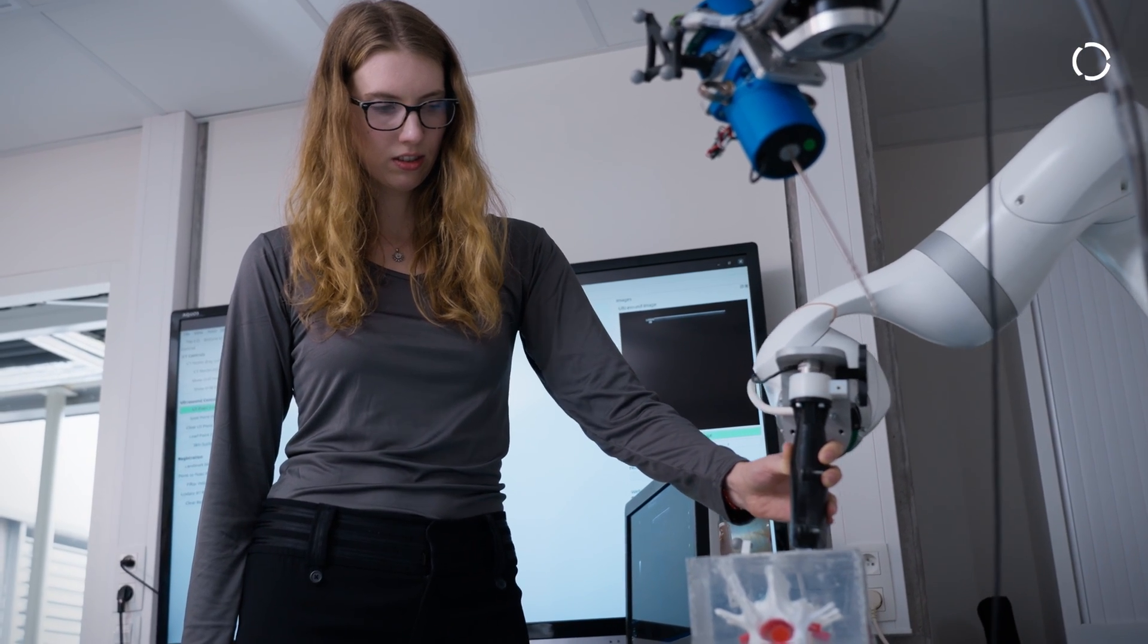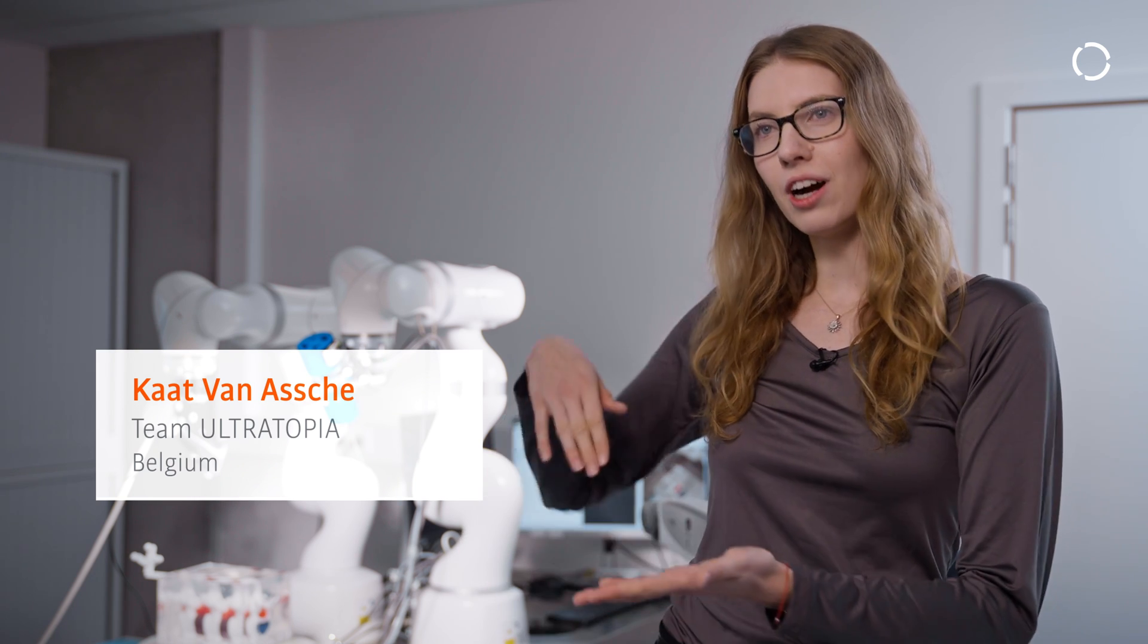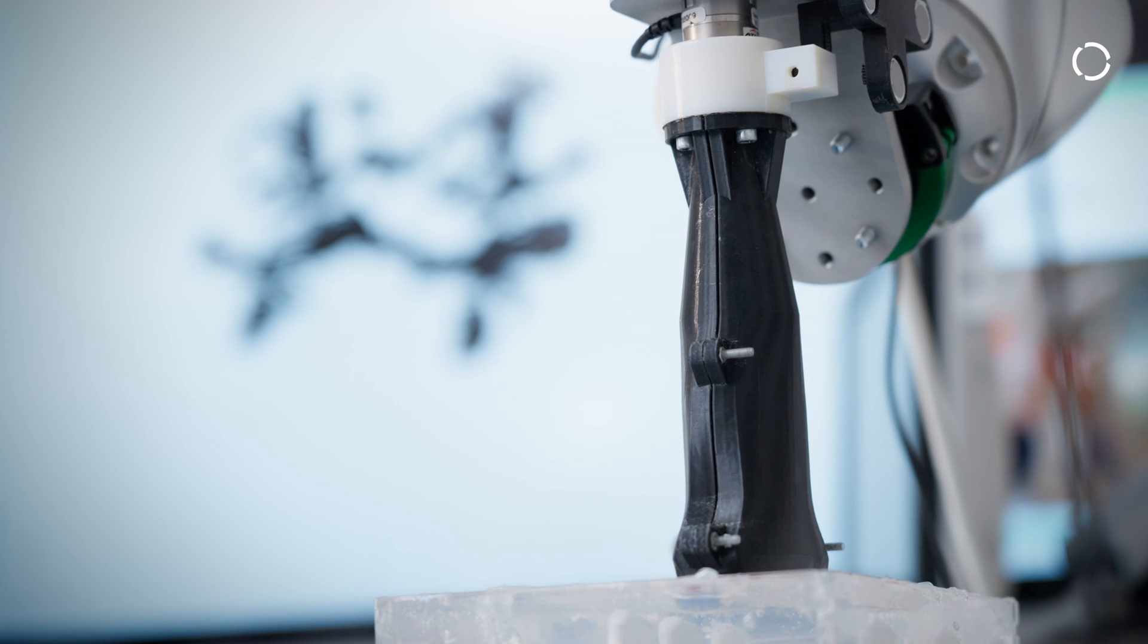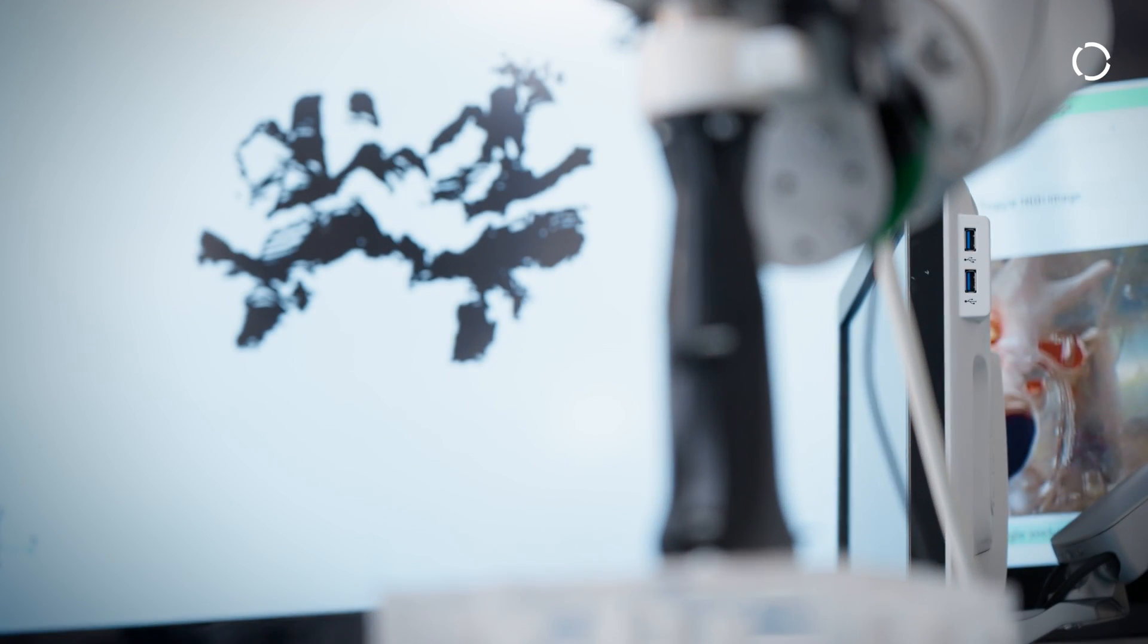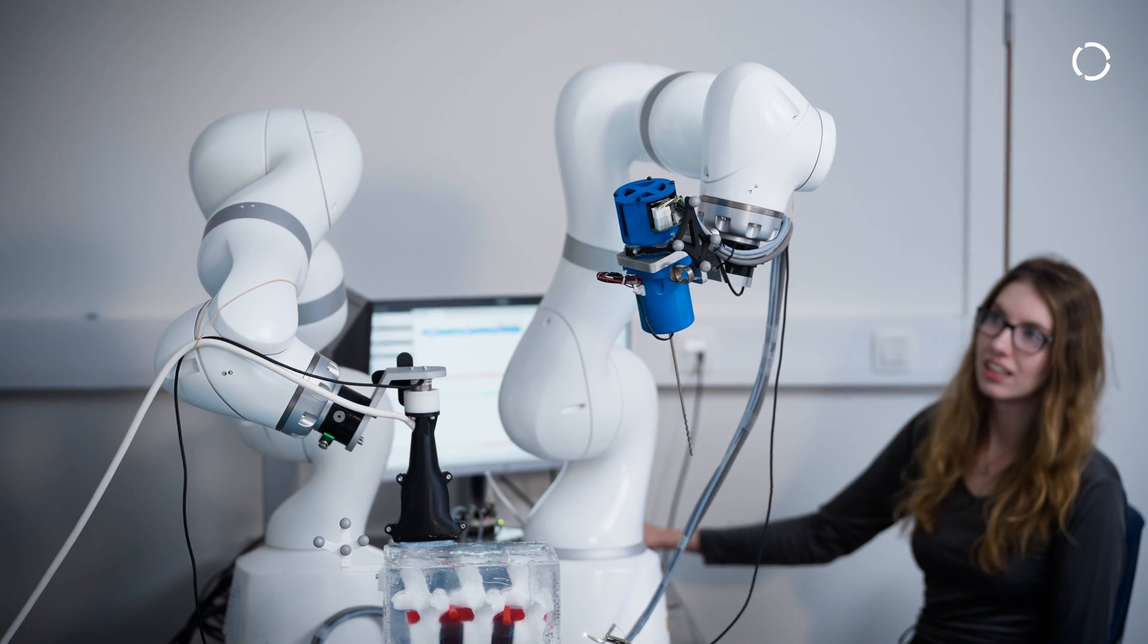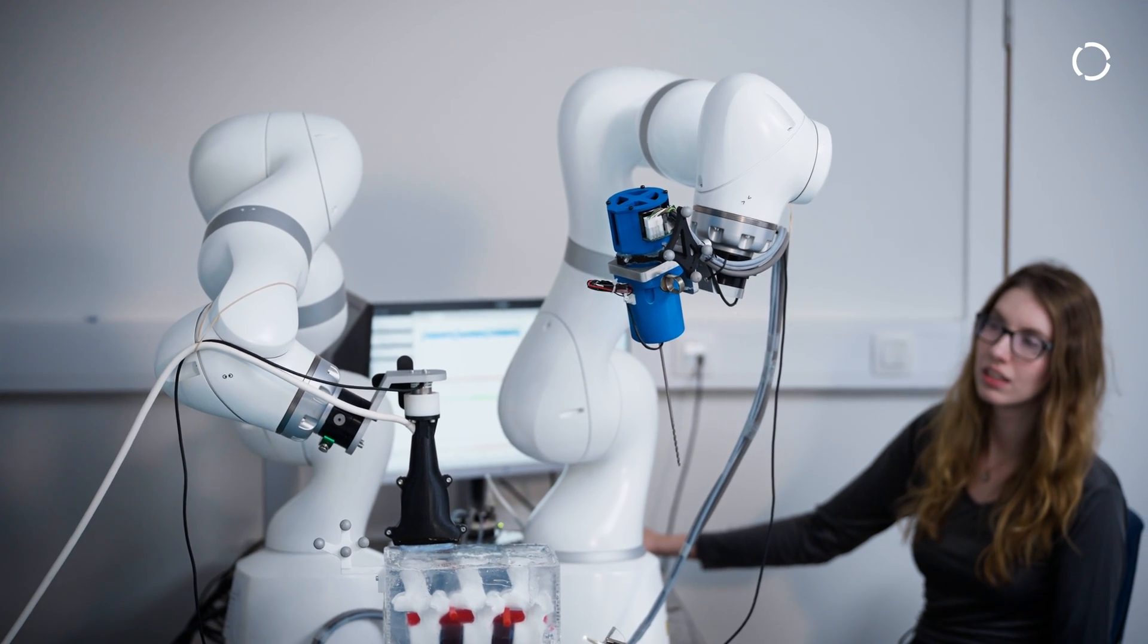Ultratopia system is a dual robotic system that will assist surgeons in pedicle screw placement. One arm will do an ultrasound scan on the patient's spine, and at the same time we automatically generate a 3D model of the patient's spine, and the second arm will then go along the computed drilling paths based on this 3D model.